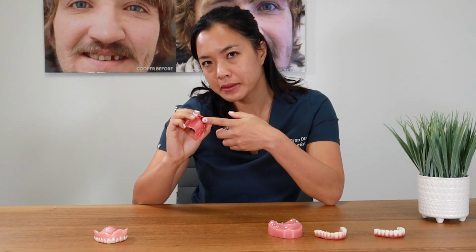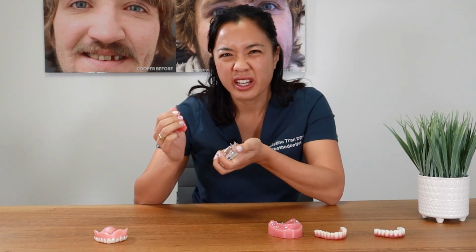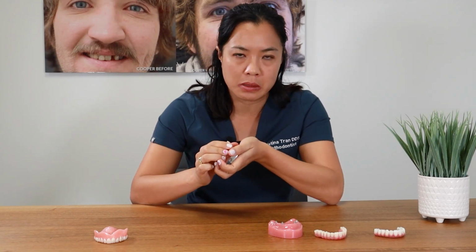The inside of the denture will have clips, colored clips, or kind of like O-rings that engage the implants, and these wear down with time. Most patients need some sort of maintenance every 3 to 6 months for the clips, and that is an added cost that you need to consider when pursuing snap-in dentures.